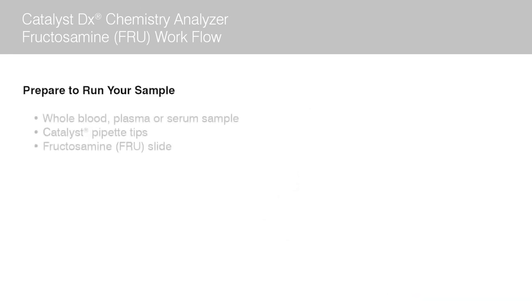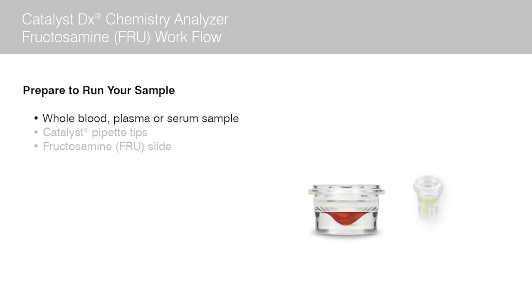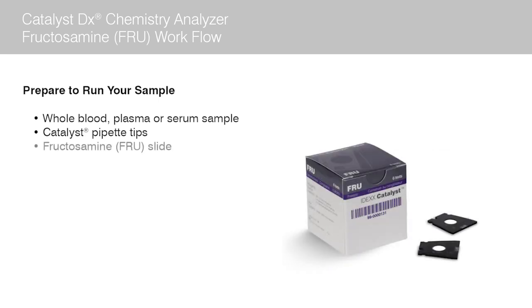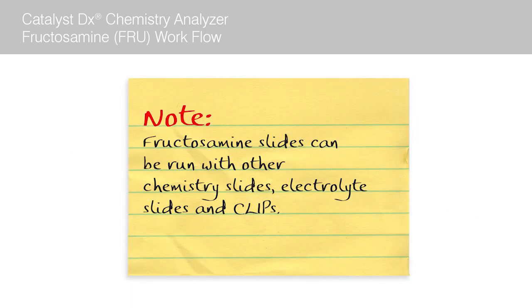Before you begin, it's always good practice to have the following supplies and equipment on hand, staged and ready to go. You will need a whole blood, plasma, or serum sample. You will need to make sure the tip drawer in your Catalyst DX is full before you start any run, and you will need a box of fructosamine slides. Note, fructosamine slides can be run with other chemistry slides, electrolyte slides, and clips.